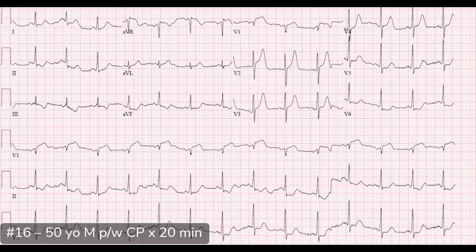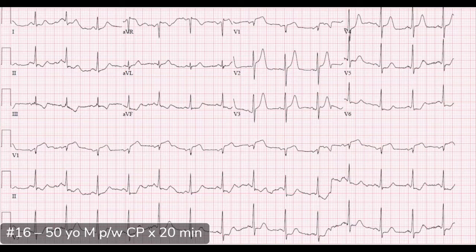This ECG was sent to us by one of our recent graduates and one of our senior residents working at a community site. There's a proud papa in Dr. Cooper for this one. So this is a sinus rhythm with a normal rate, normal axis, and normal intervals. The real meat and potatoes of the ECG is when we start looking at ischemic changes.